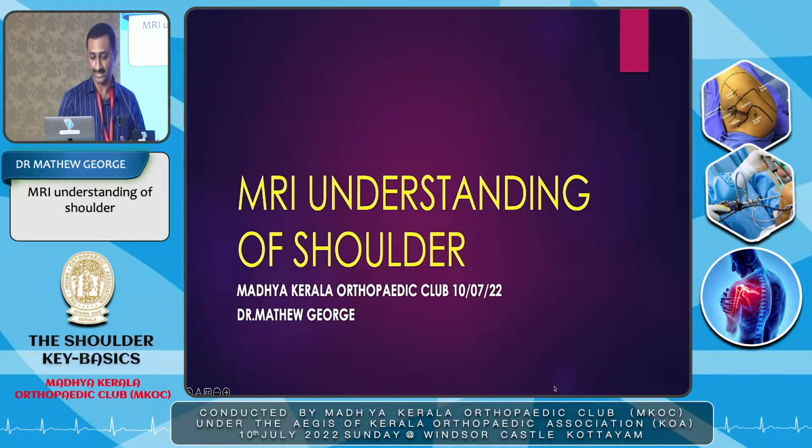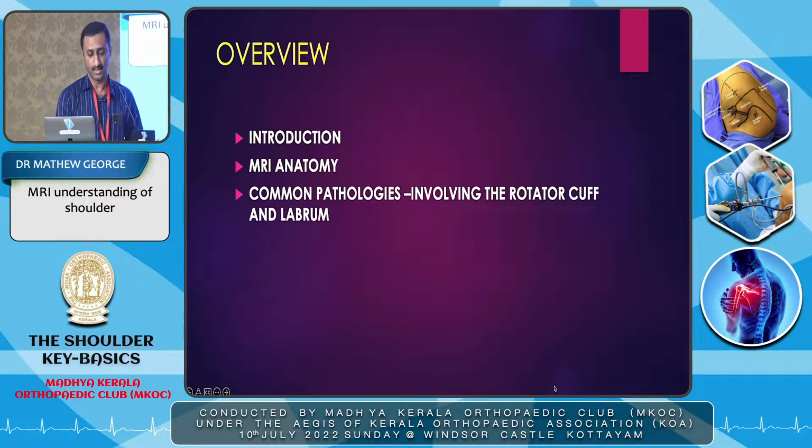So, the topic today is MRI understanding of the shoulder. Now, just an overview of what I'll be taking. I'll take a small introduction and then go into MR anatomy, and then we'll go into some common pathologies, mainly involving the rotator cuff and the labrum.